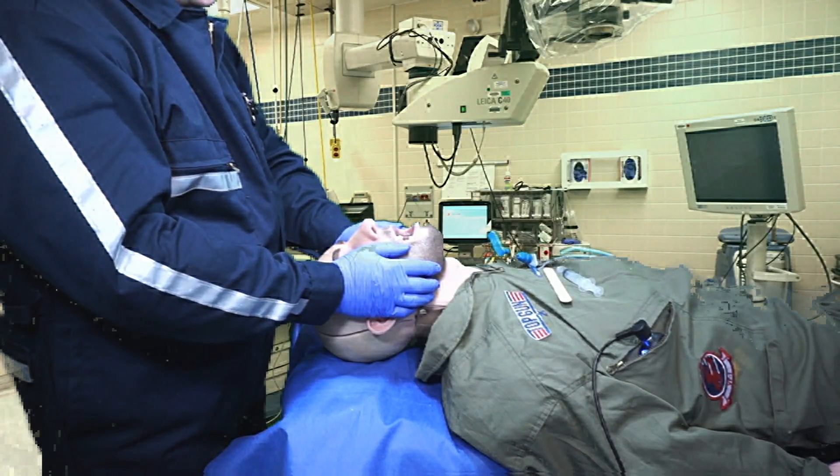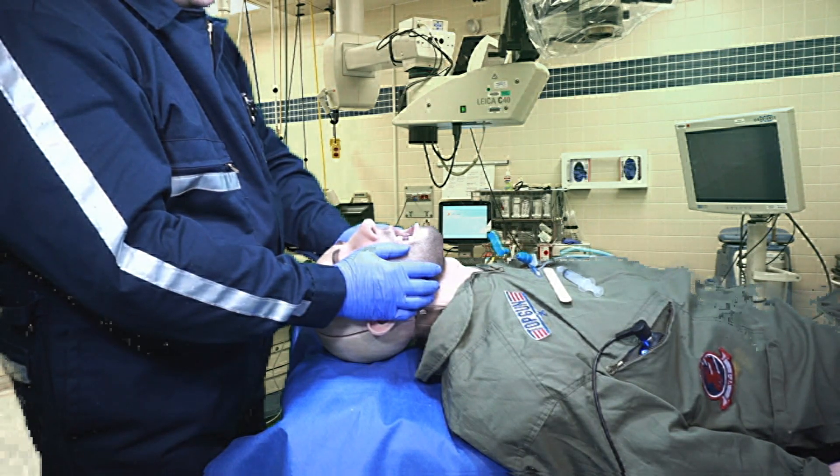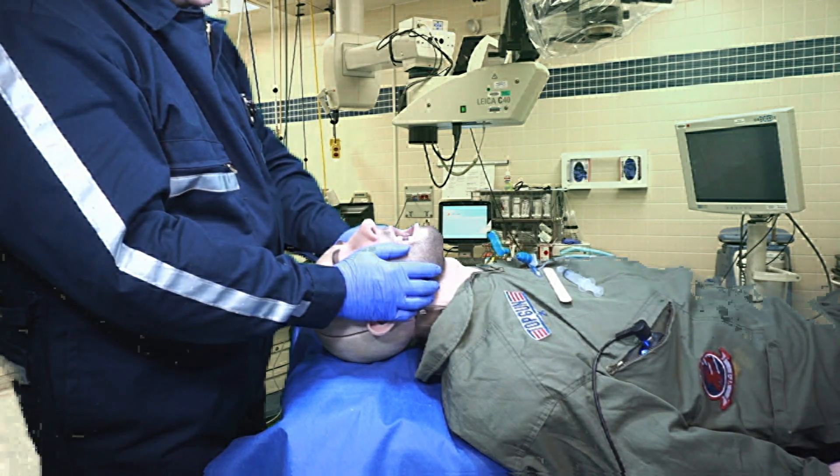This is the Seven Sigma Swollen Airway Model. We're going to do an exploration of what it takes to expose the larynx and deliver a tracheal tube.